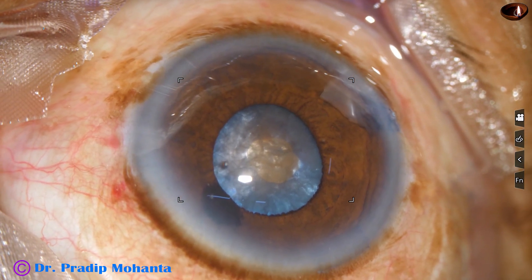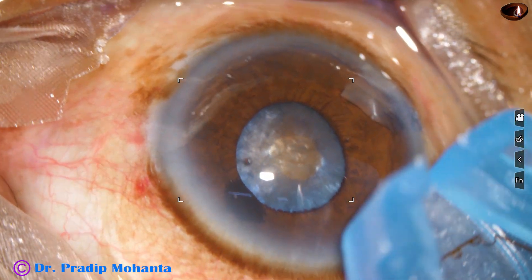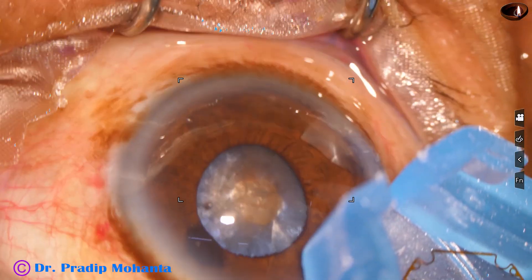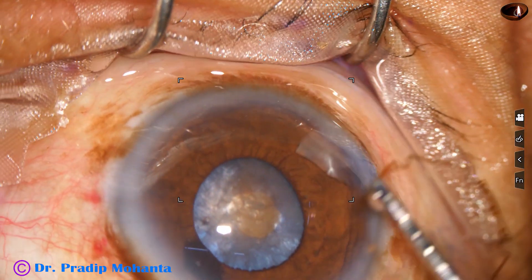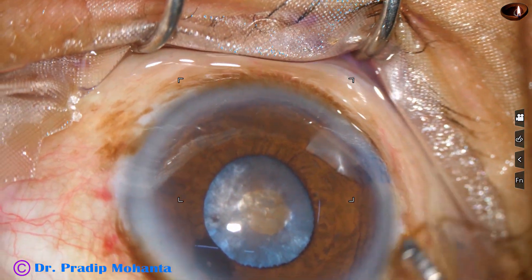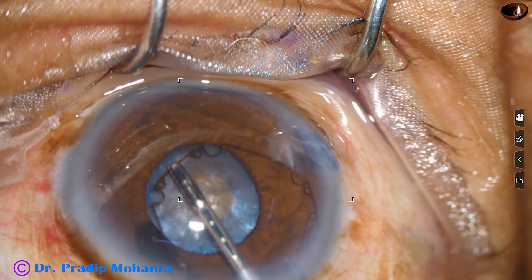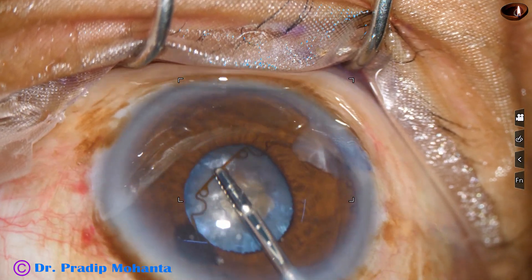Visco is injected. Some amount of visco has been injected behind the iris to make some room. And this is the B-Hex Pupil Expansion Device. I am very proud of my colleague, Dr. Subhan Bhattacharji, who invented this device in Kolkata.